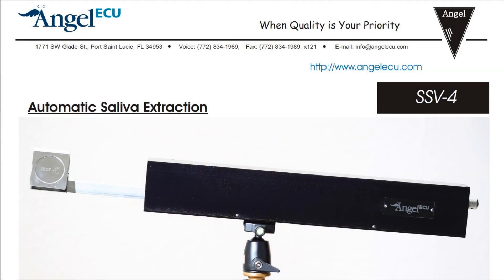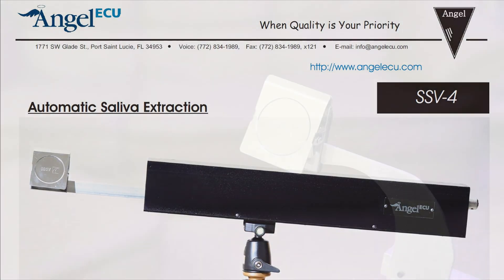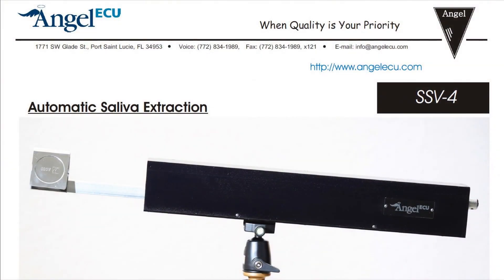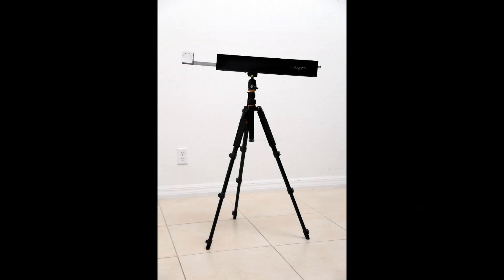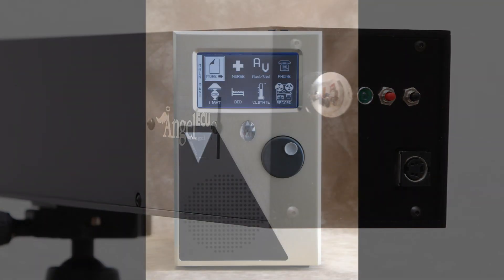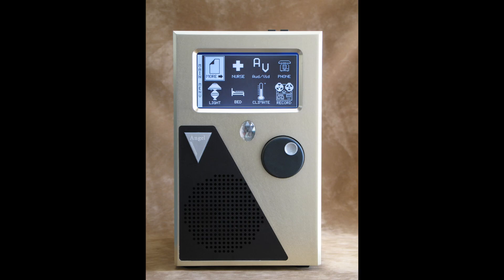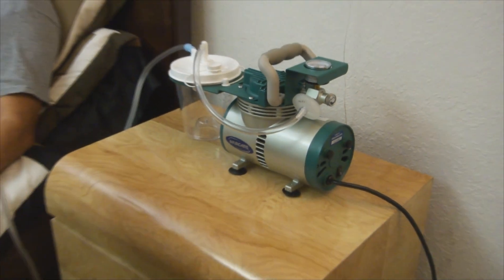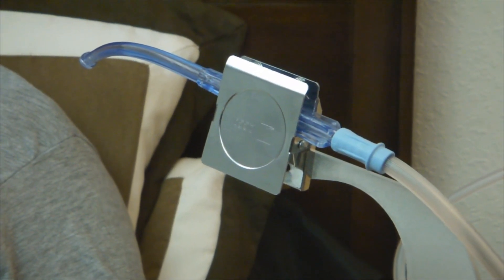Stay tuned for a demonstration. The SSV4 features a servo-driven extendable arm with programmable range and a spring-loaded clamp for holding the mouthpiece or yanker of a vacuum pump. The SSV4 connects and operates as a peripheral component of the ANGEL FX ECU. Working together with the FX ECU and a medical vacuum pump, the system allows an individual to extract excess saliva by themselves in an automated fashion. Let's take a look at a demonstration.